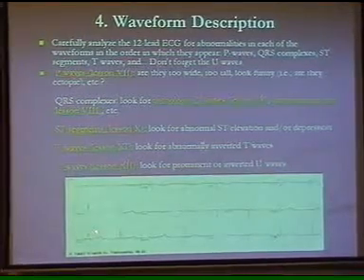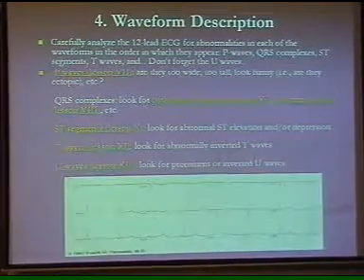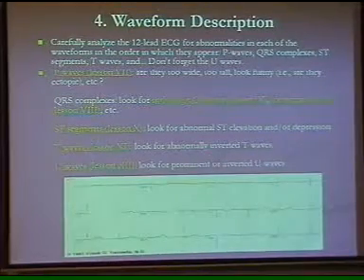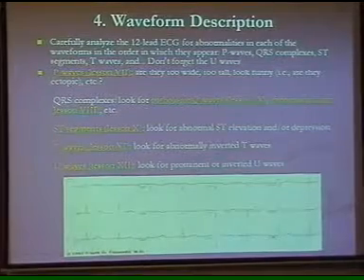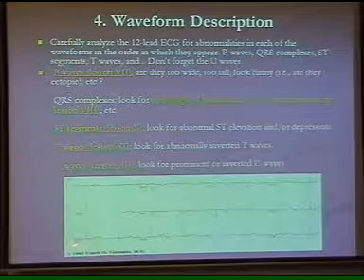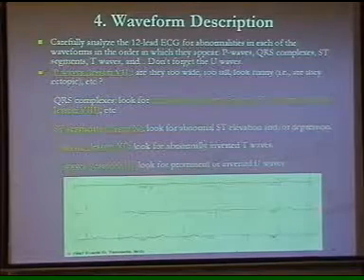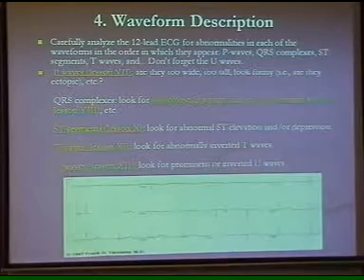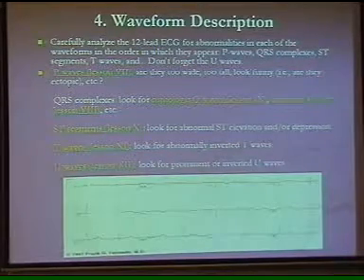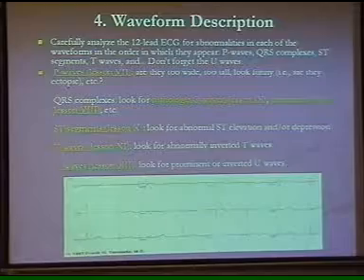If we basically compute the heart rate, it's a lot easier to remember that you either do 1500 divided by RR interval in small squares, or 300 divided by RR interval in big squares, or the latest paper ECGs are 10 seconds across. So if you just count the number of complexes here and multiply it by 6, that will be your heart rate. Okay, can we go back?